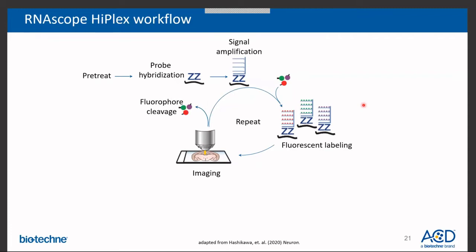Now, at this point, you're probably wondering a couple of things. 1, how on earth do you decover slip of tissue without completely destroying it? And the key is to mount with the recommended mounting media, Prolong Gold. Prolong Gold doesn't hard set, so you can soak and buffer these slides, and the cover slips actually float off in just about 30 minutes to an hour. Kind of amazing. You also need to make sure that you do not nail polish the cover slip onto the slide, otherwise that's going to create a problem.